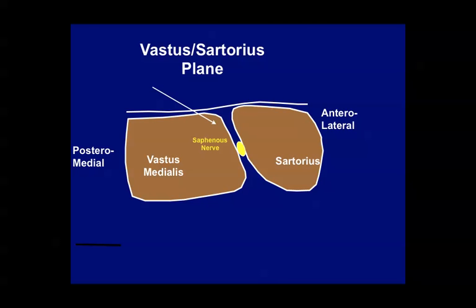With this image that we just saw now in cartoon form here, we can see that if the needle passes through this space, there's a chance that if the opening is only at the bevel, we would not get an effective block.